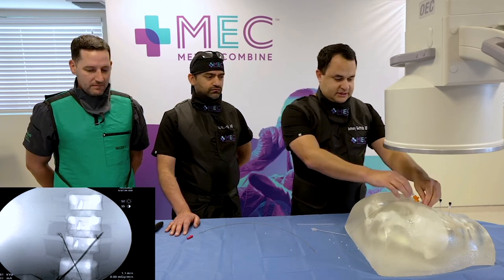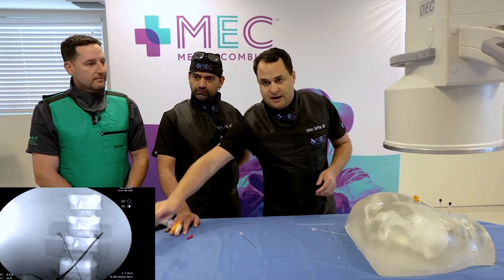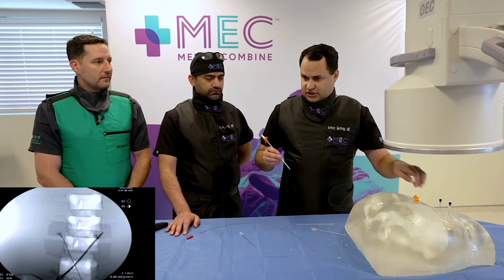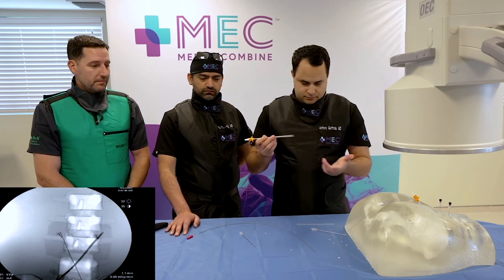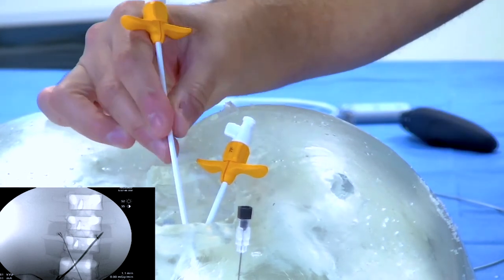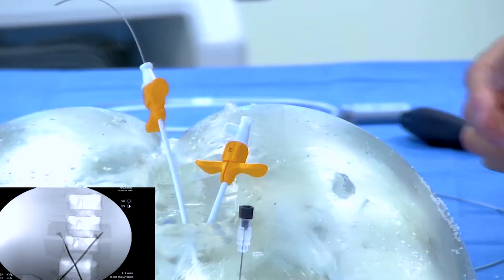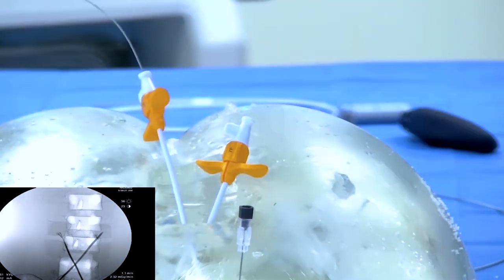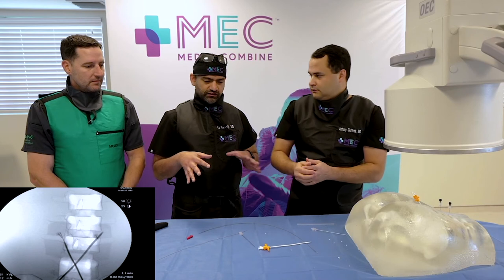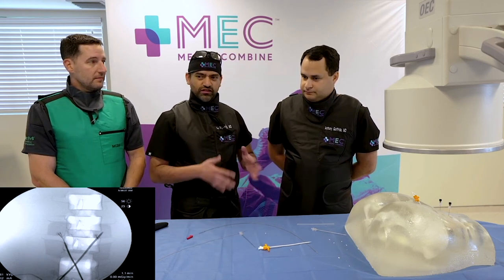We pull the needle out and have our guide wire in place. The next step — which I won't do fully on the model — is making a nick in the fascia and sliding the 7 French sheath right over. In a patient, it goes through really nice. Make sure you're not pushing or pulling the guide wire — you want it to stay in that spot. If you're doing peripheral nerve stimulation implants, this is almost the same approach in terms of tool sets, guide wires, tines on the leads, and introducers — very similar.